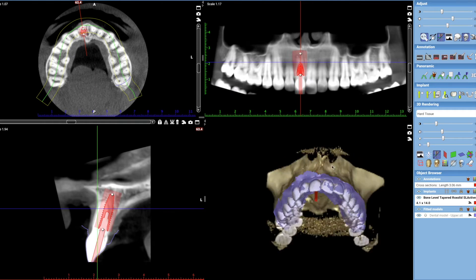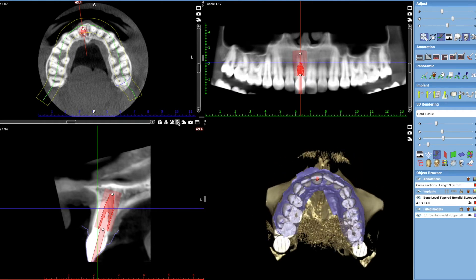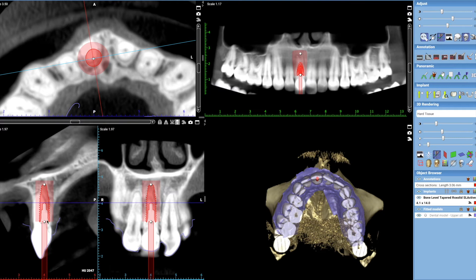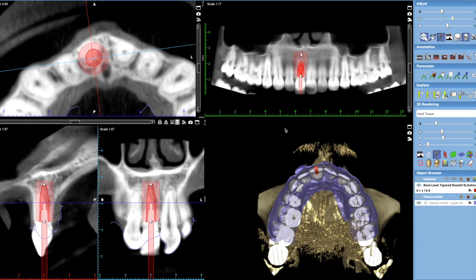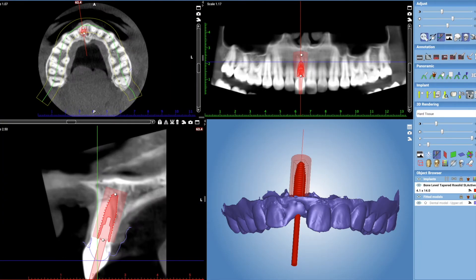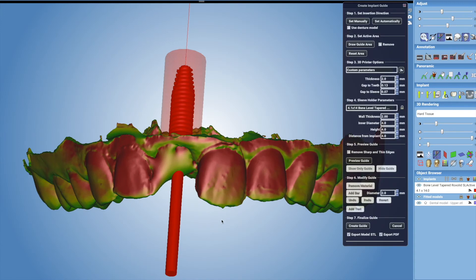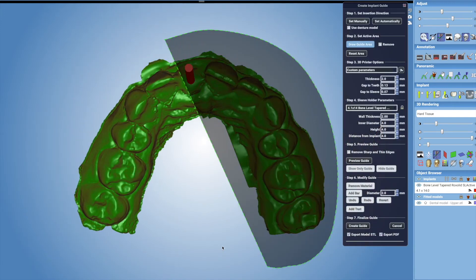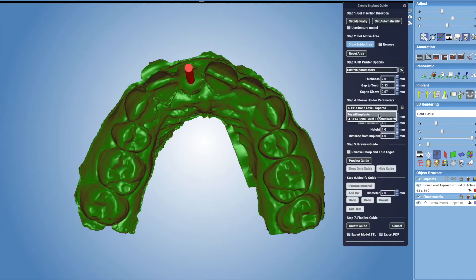The implant is placed in the ideal position for both the aesthetics and the function of your new tooth. Once we have the implant in the right position, we then need to transfer this position to the patient's mouth, and to do that we need a surgical guide. We design this guide virtually using the Planmeca Romexis software.